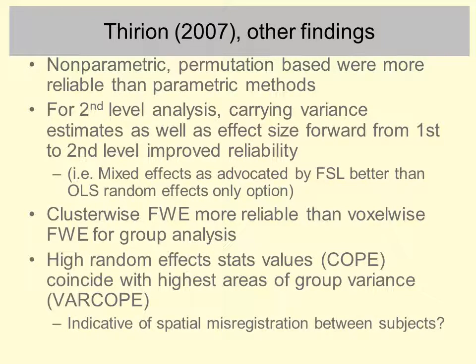They also observed that high random effects stats values, that is high values in the COPEs and in the Z-stats, tended to coincide with the highest areas of between participant variance, which they suggested may be due to poor spatial registration between participants.